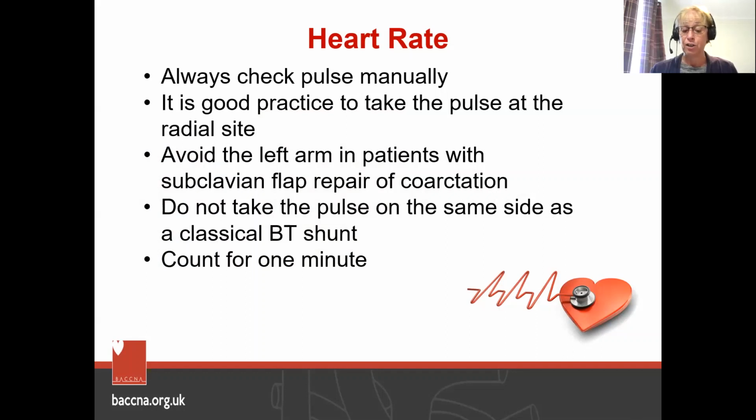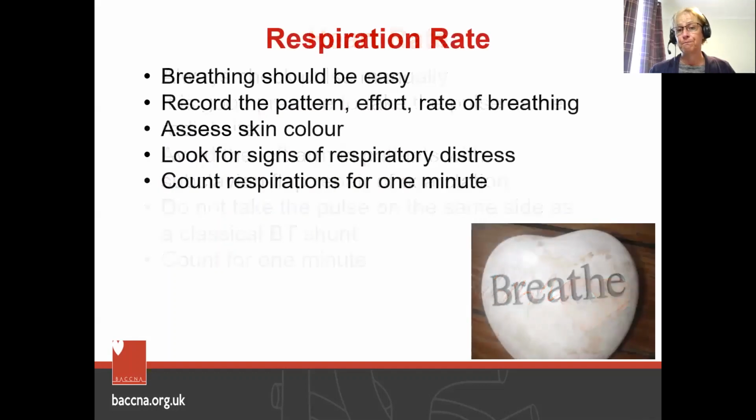It is okay to check the heart rate using a stethoscope to auscultate the apex heart rate if required, but it shouldn't replace checking the heart rate manually. Checking manually allows you to check not only the heart rate, but also the characteristics of the pulse. So you can check whether it's full and bounding or whether it's weak and thready. And it also helps to establish whether the heart rate is regular or irregular. And it's important to count the heart rate for 1 full minute, noting the rate, the depth, and the rhythm.